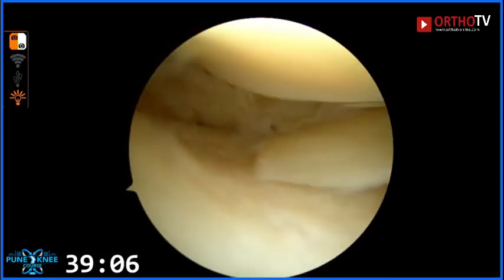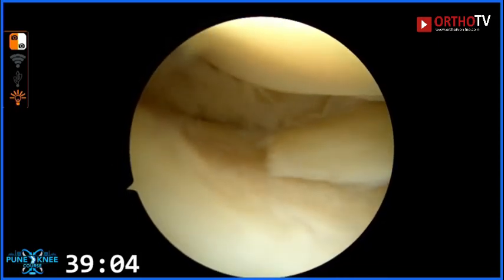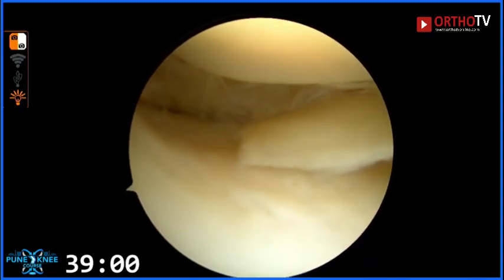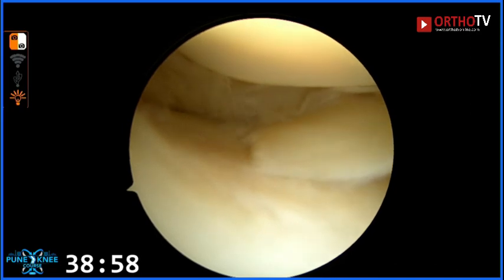So this is what we started off with. You can see that it's a flap that starts in the posterior horn. Can we move forward a bit? Just a little.